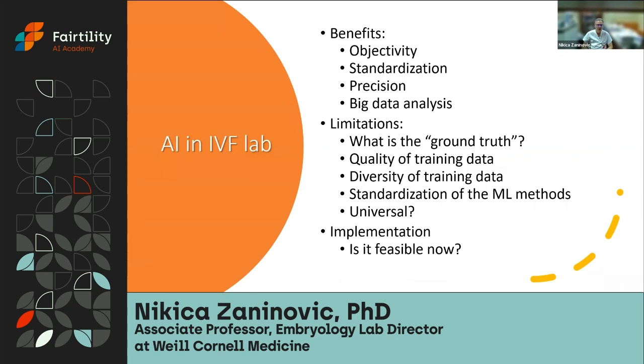In my opinion, these are the benefits and limitations of AI in the IVF lab. First of all, it's going to give us objectivity. We're going to eliminate the subjectivity of each of the humans within the laboratory. It's also going to give us standardization, not only in embryo evaluation, but standardization through the processes of what we do. It's going to give us precision, because we have to lead toward precision medicine. And also, it's going to give us options to use big data analysis.